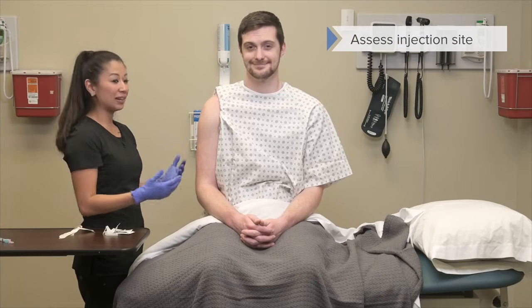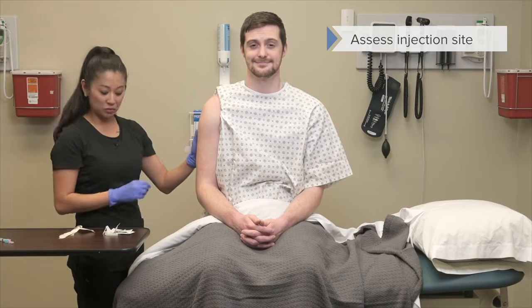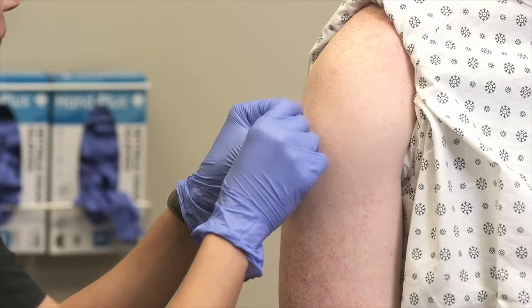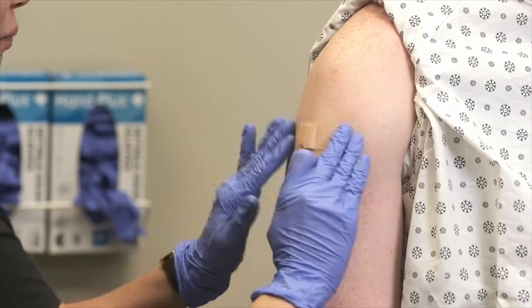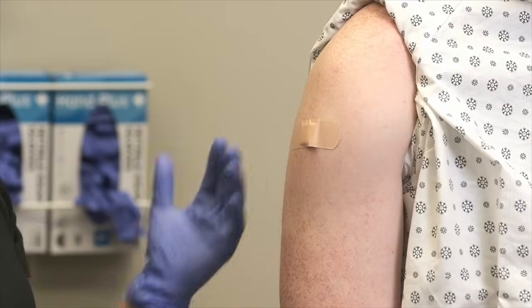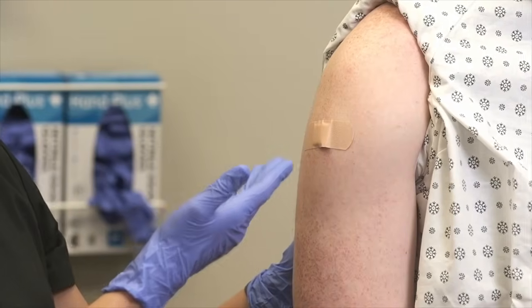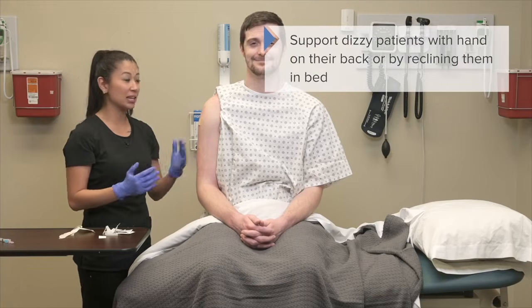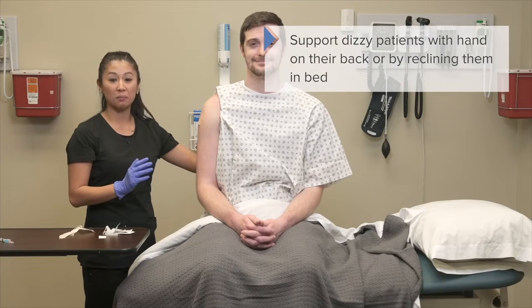So, luckily my patient's done really well, right? He stayed relaxed. Keep in mind where you have your patient when you do this. Luckily he's not bleeding. If he does, we've got our Band-Aid here. We can go ahead and apply. But one thing to consider, anytime you have a patient up and you're going to give an injection, some people may get a little woozy. So if you think that person is, then you may want to lay them back in the bed.